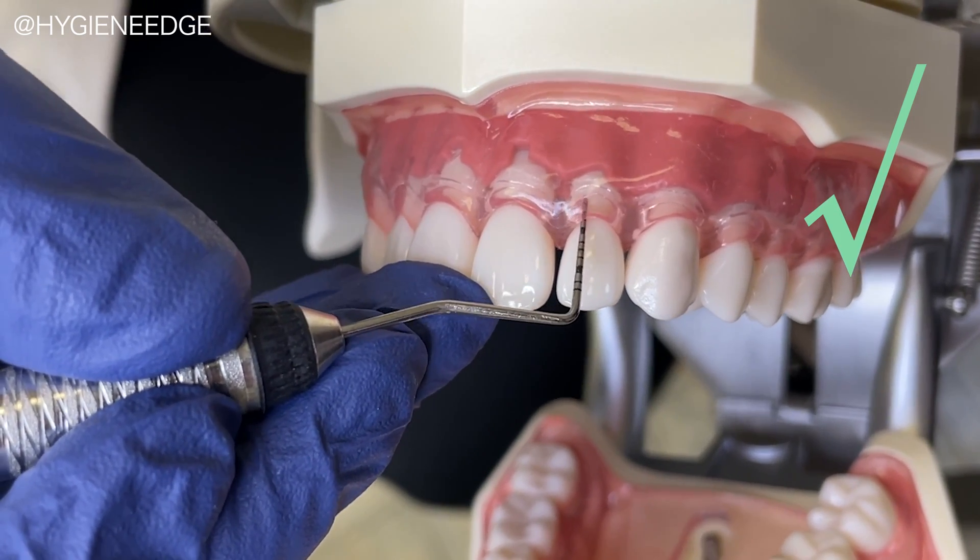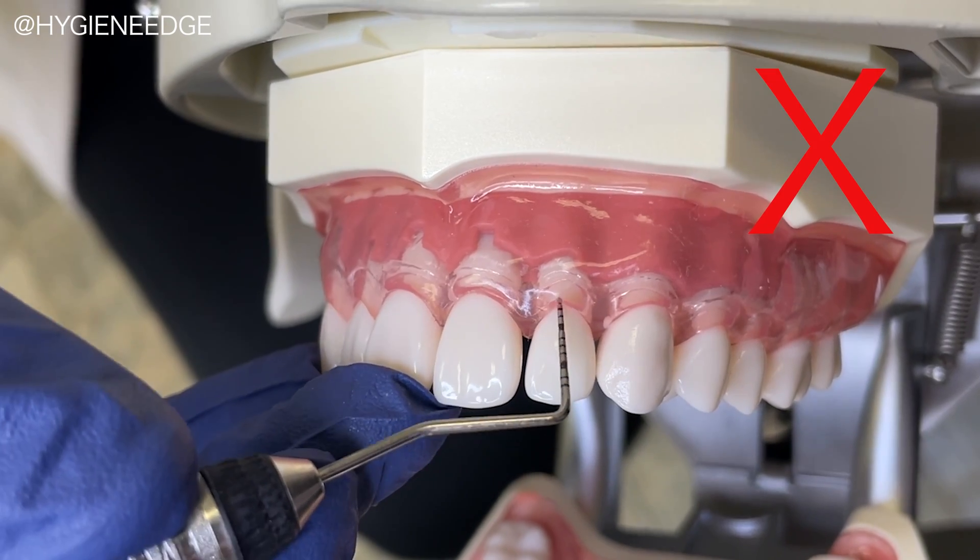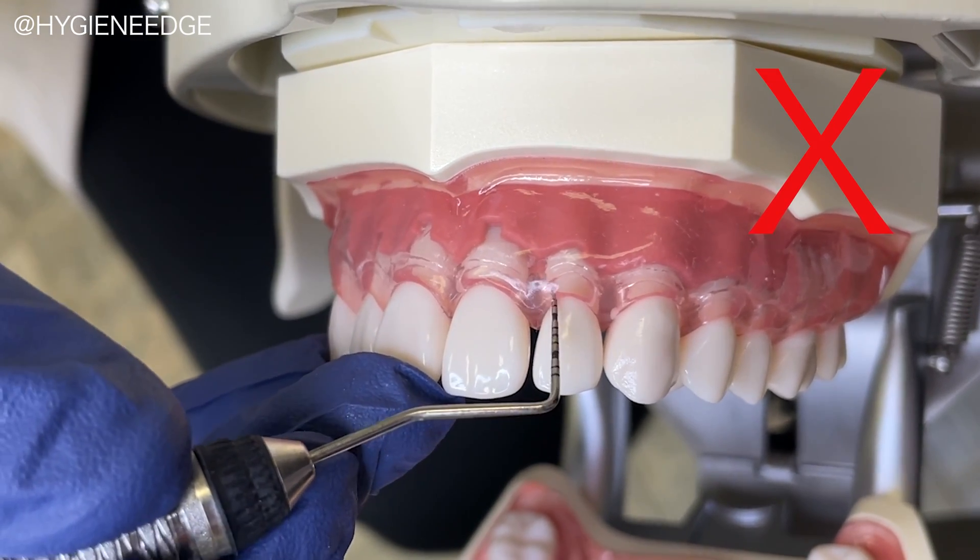Be sure to keep the tip in contact with the tooth versus lifting it off before reinserting after each bob.